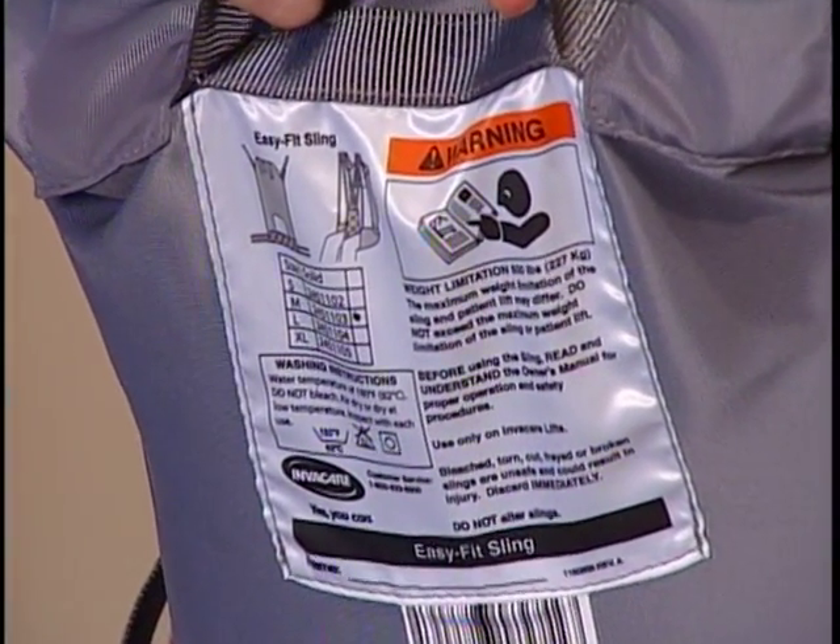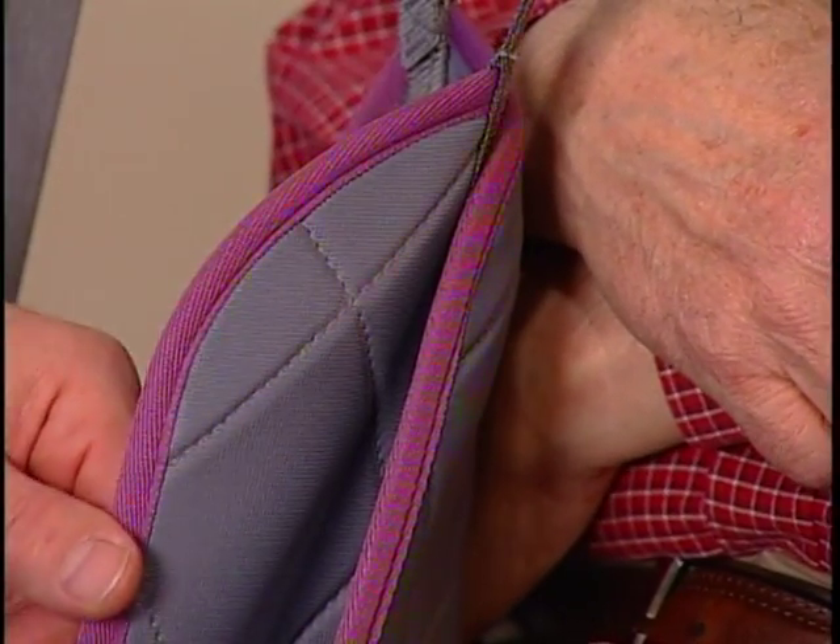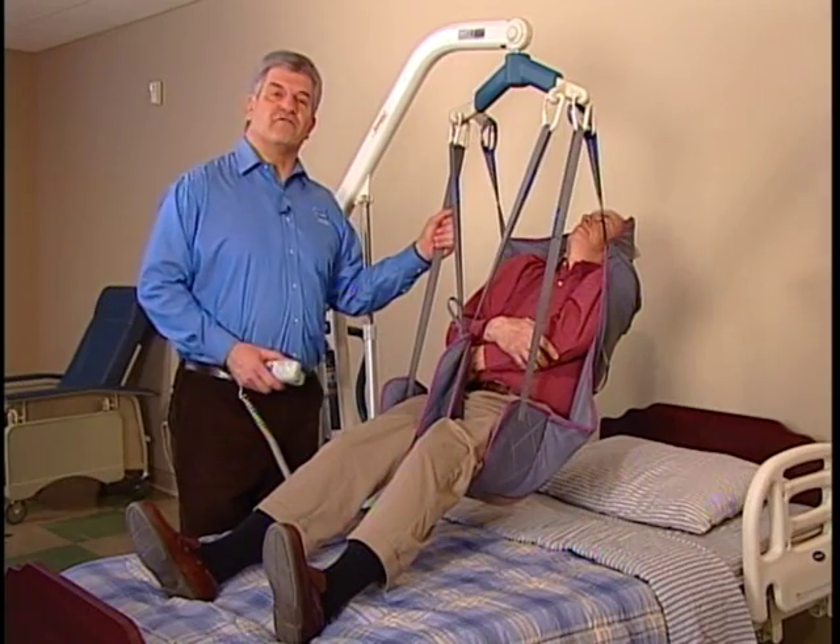Sizes are indicated on the labels and by the outer binding color. Refer to the sling chart in the owner's manual for dimensions.